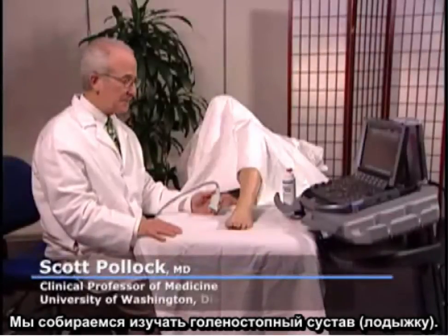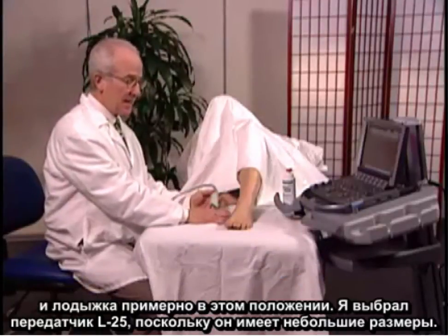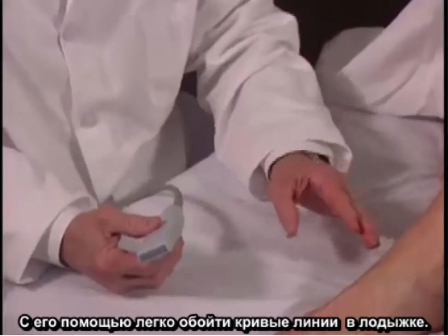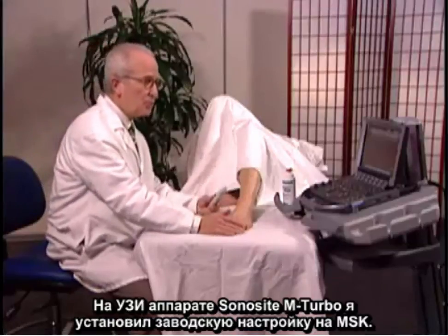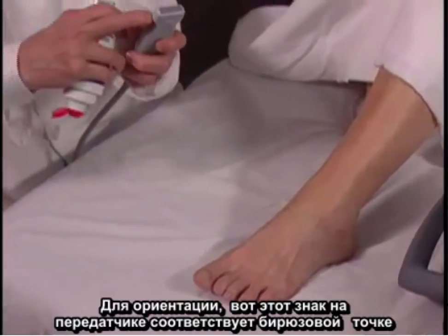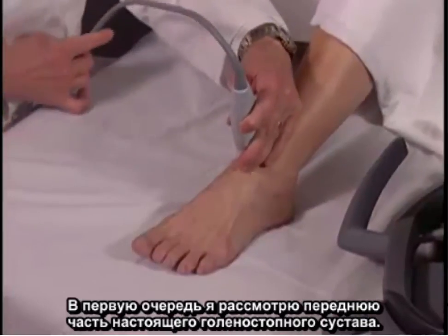We're going to examine the ankle. The patient is lying on her back with her knee flexed and ankle in approximately this position. I've selected an L25 transducer because it has a small footprint and it's easy to get around the curves in the ankle. On the Sonosite M-turbo, I've set the factory preset for MSK. For orientation, the mark on the transducer corresponds to the turquoise dot on the upper left portion of the screen.